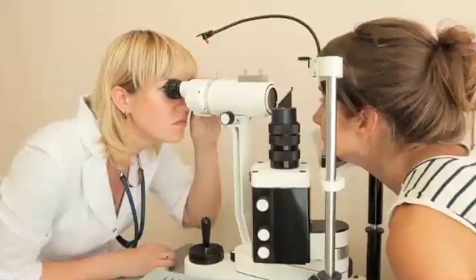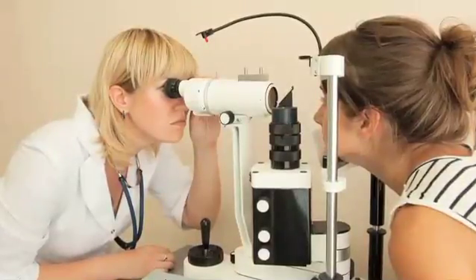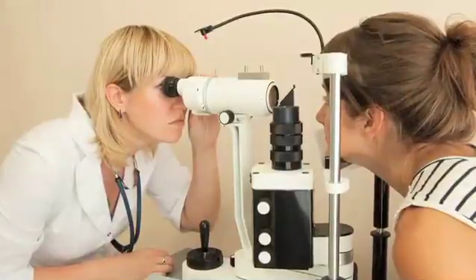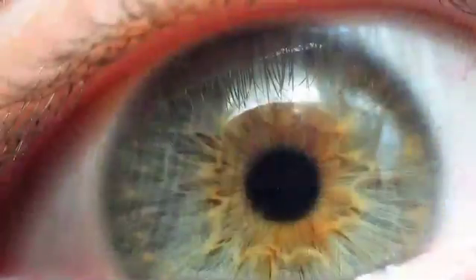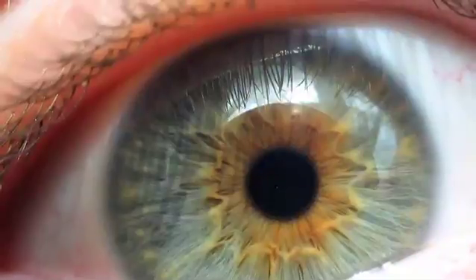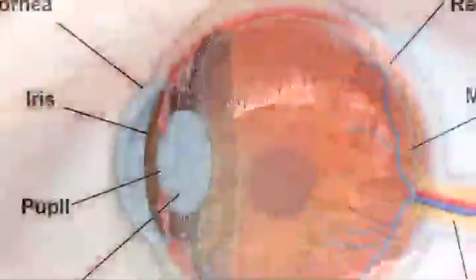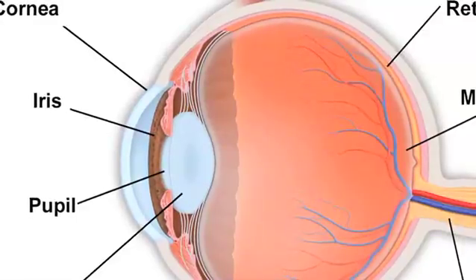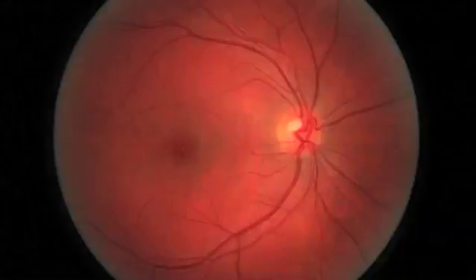What is the procedure and general process for bladeless LASIK? As usual, we evaluate the patient and first determine if they're a good candidate. We run a host of examinations, everything from anterior segment examinations to make sure that the patient has a healthy eye, both in the surface of the eye as well as in the curvature of the cornea, the thickness of the cornea, the health of the tissue inside the eye, as well as the retina, the lens.